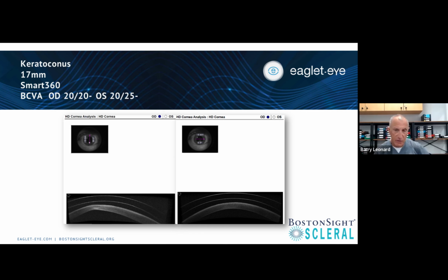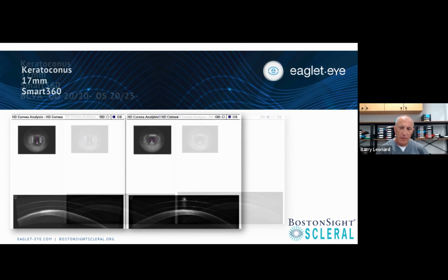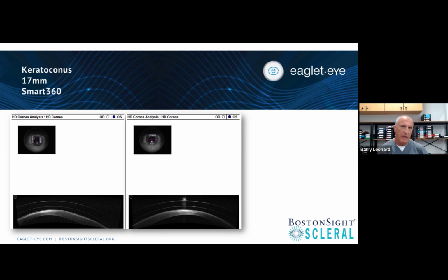Here you can see in that vertical cut over here on the right eye, that typical sag at the bottom, but we're really following that cornea well. And the software is able to, by knowing our HVID and VVID, really predict getting this oval optic zone. We're now able to much better follow the limbus all the way around, and we'll go through that on some other cases here.